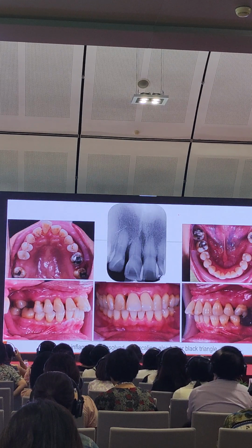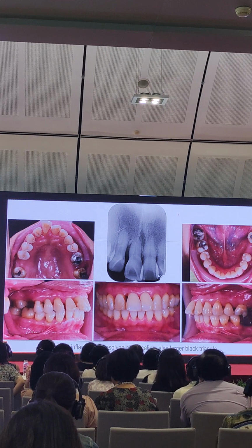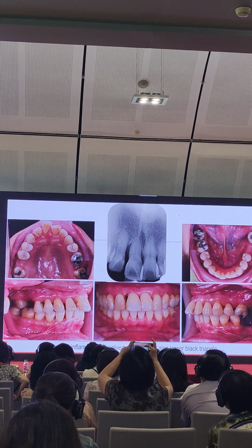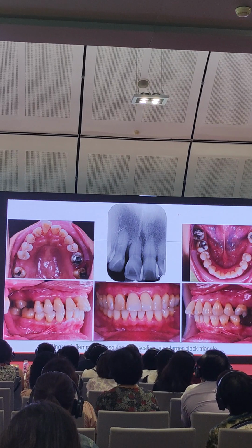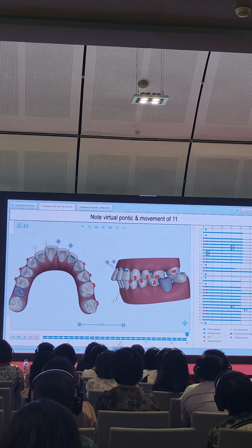So what we need to do is try some periodontal treatment on all the teeth, especially from 1-1. After the treatment, you can see the inflammation resolved, but there is also a larger black triangle. So no matter what, we put the perio situation into a more stable condition.